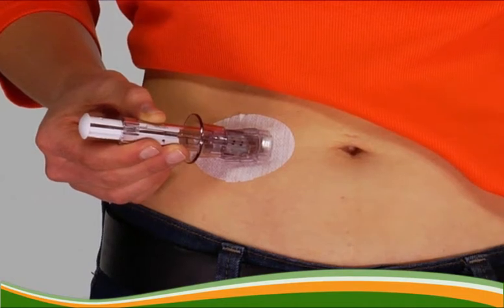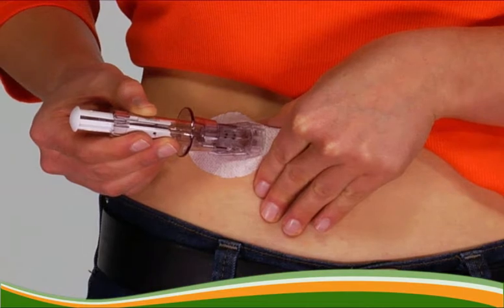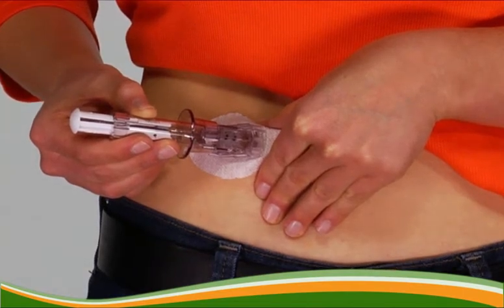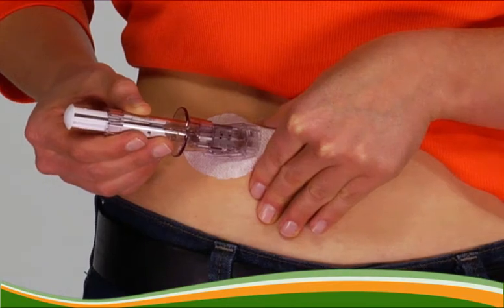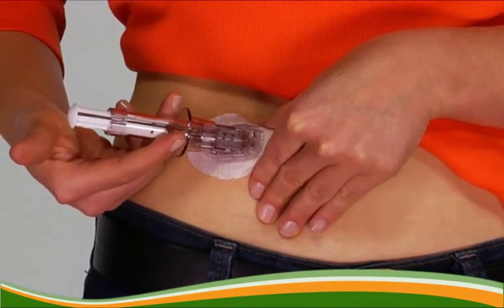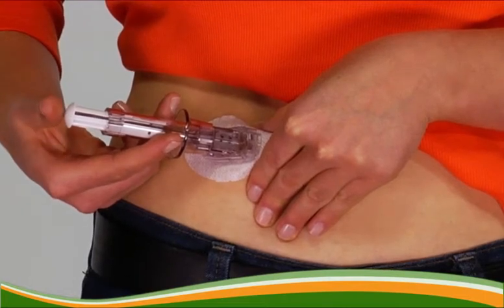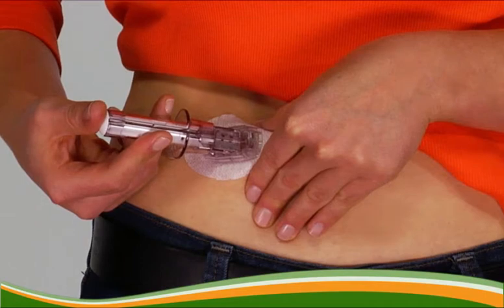Using the thumb and forefinger on your non-dominant hand, you may want to pinch up on the tips of the white adhesive on your skin at the base of the sensor pod. With your dominant hand, place 2 fingers above the sensor applicator collar. Put your thumb on the plunger and push down completely. You should hear 2 clicks.